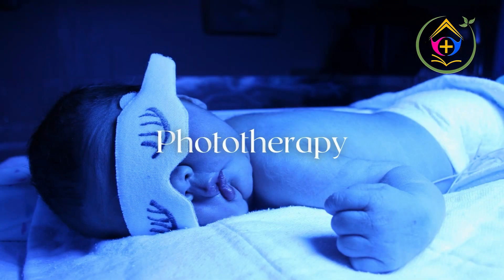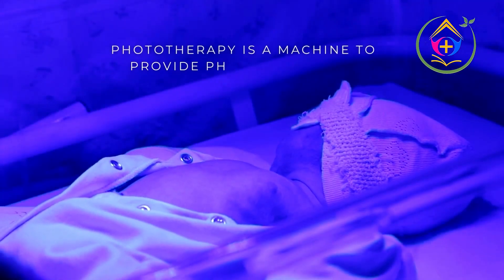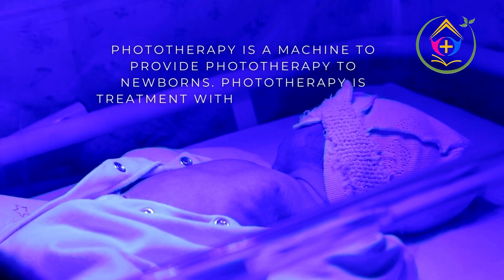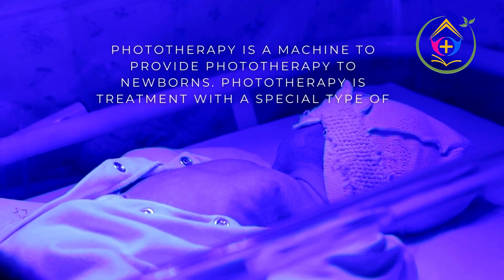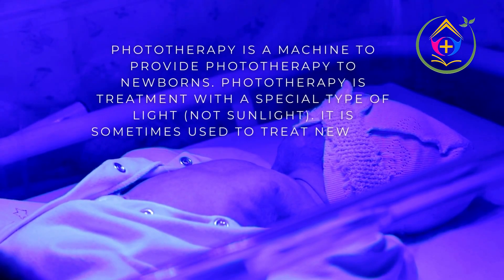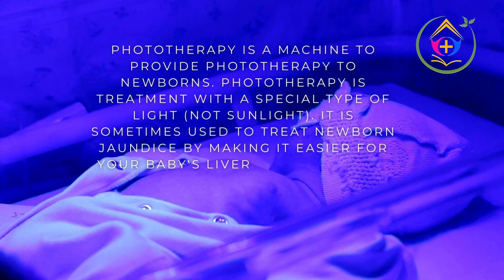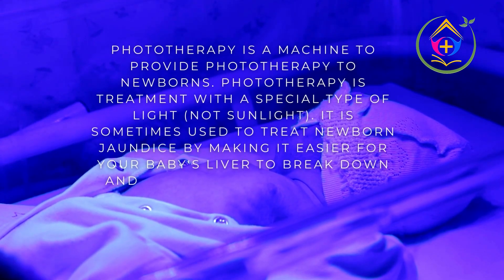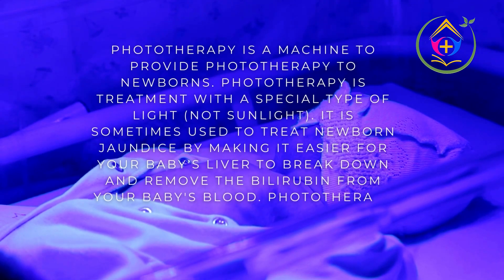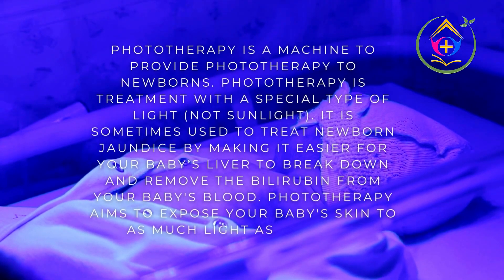Phototherapy: a machine used to provide phototherapy to newborns. Phototherapy is treatment with a special type of light, not sunlight. It is sometimes used to treat newborn jaundice by making it easier for your baby's liver to break down and remove the bilirubin from your baby's blood. Phototherapy aims to expose your baby's skin to as much light as possible.